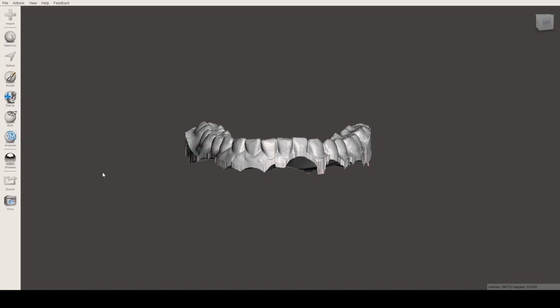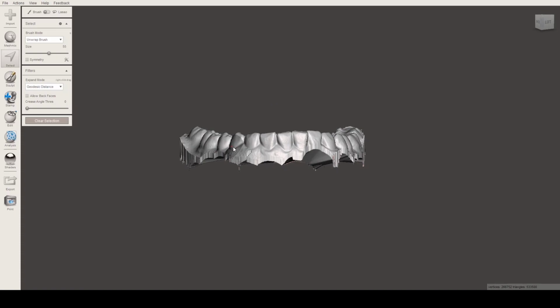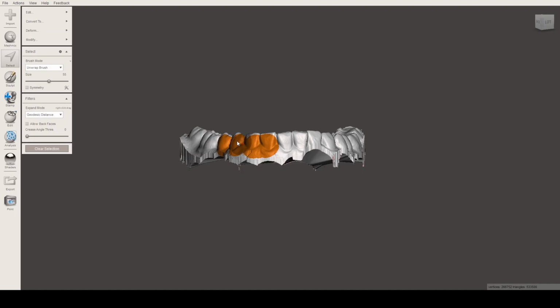Sorry about that. Anyway, what we're gonna do now is select a portion. There are two kinds of selection here. You can select with this circle or with this cursor. You can select a specific portion with your cursor, and resize it with the brackets, so you can make it smaller or bigger. It doesn't really matter as long as you select the part. It's basically up to the user. If you want to select a smaller portion, you can make the area of the cursor smaller, or if you want it bigger, you can make it bigger, as much as you want.